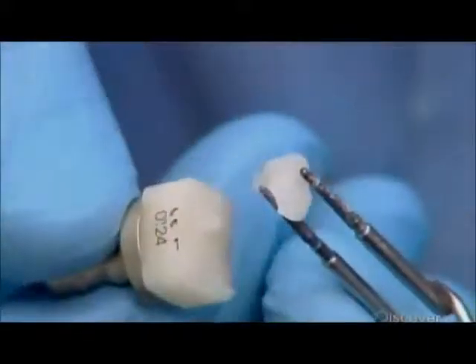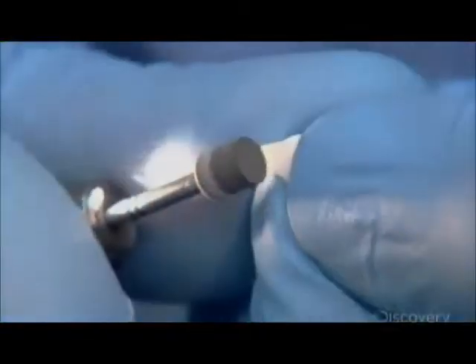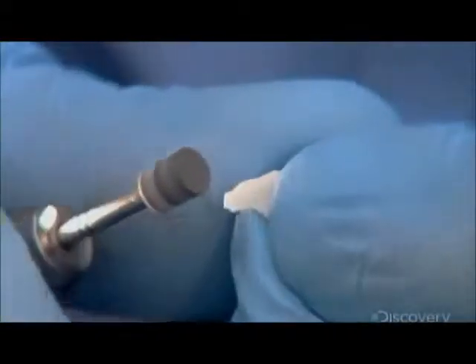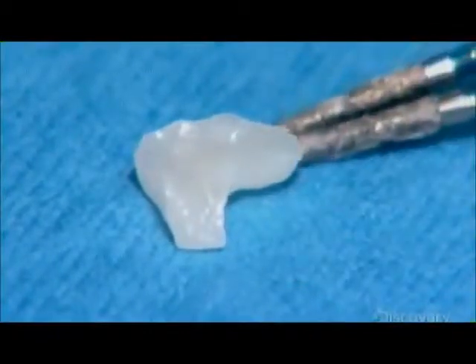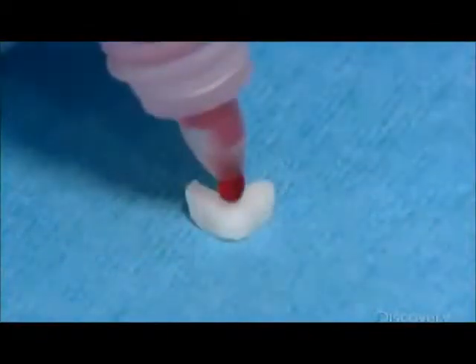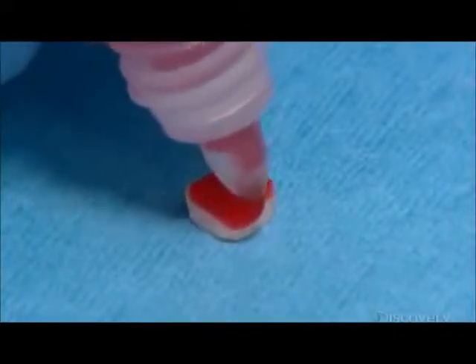The dentist then pulls the ceramic inlay from the base. This leaves a small nub, which he then grinds away. Next, using rubber wheels and diamond-impregnated brushes, he polishes the entire restoration to a high gloss. He conditions the inlay with hydrofluoric acid to prepare it for adhesion to the tooth.